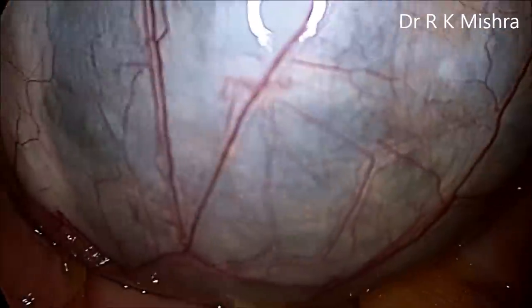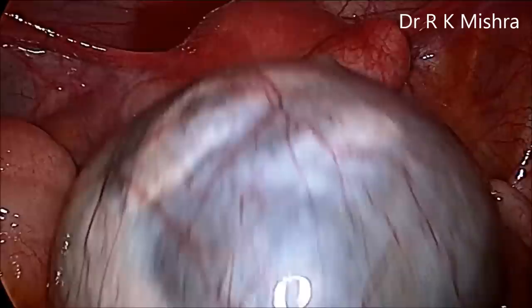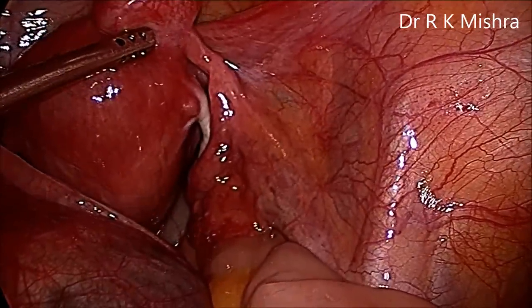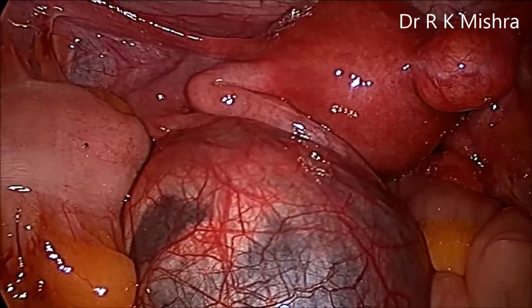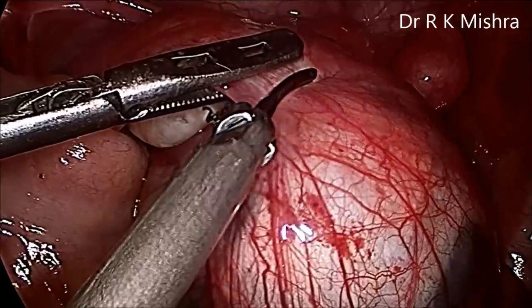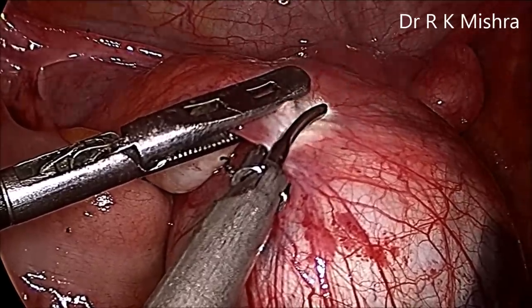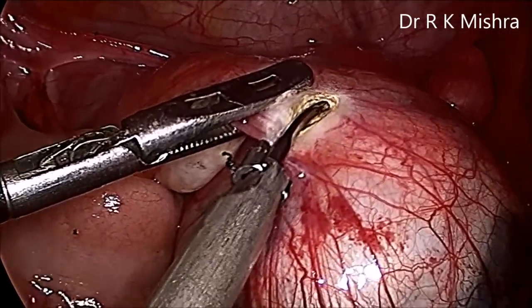This is the ovarian cyst — a quite large dermoid ovarian cyst, but it is on the outer surface of the ovary, so it is easy to remove. Here is the sub-serous myoma, approximately 4 cm in the largest diameter. There is also one intramural myoma present in the posterior wall. We are now doing the ovarian cystectomy, separating the outer serous layer from the inner ovarian cortex, and slowly it can be separated with the harmonic.